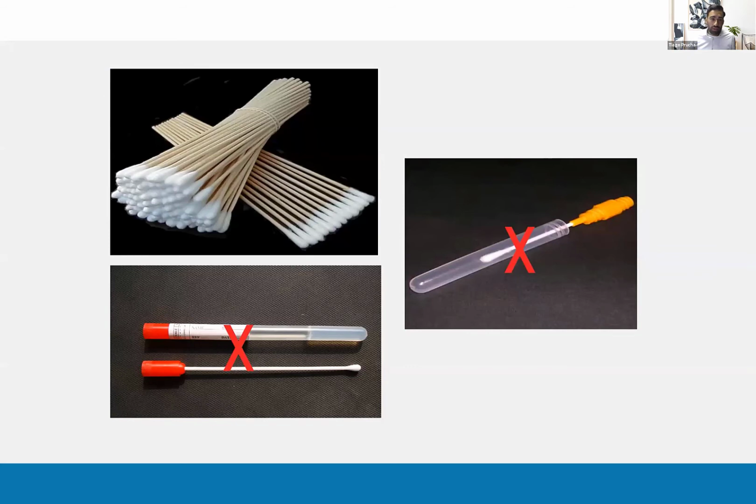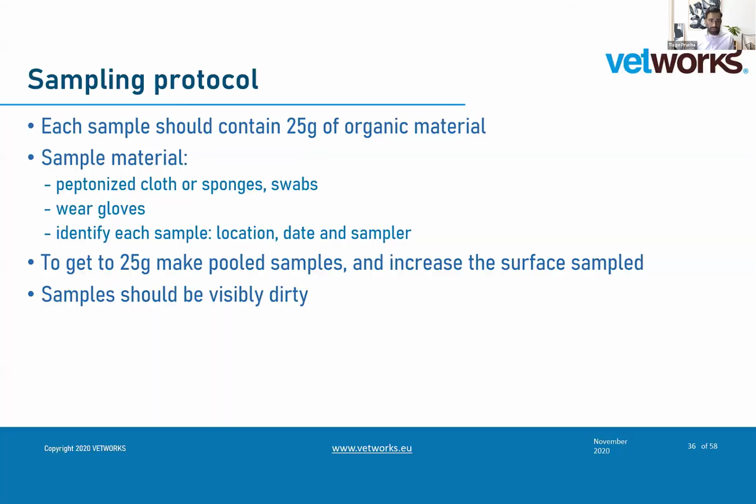Okay. An important thing to mention here is that when we are doing this kind of monitoring, we shouldn't do only one sample. It should be really an effort to take as many samples as you can. Also, if you do pooled samples, it's a nice way to have several surfaces in the same swab, for instance. But it's really important to mention that Salmonella is easy not to find, and only one swab really doesn't get you anywhere. So you need a lot more samples to find it.